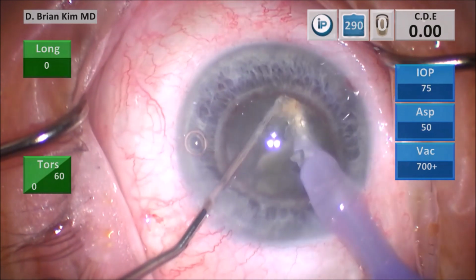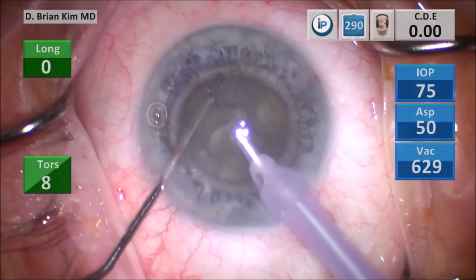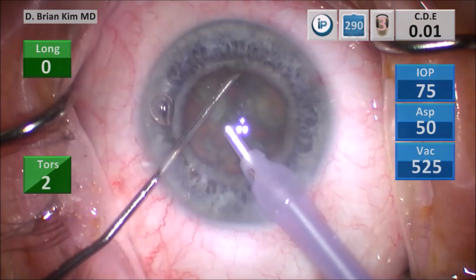I place the chopper out to the contralateral equator, again, making sure I'm underneath the epinuclear material. I rotate my hand 90 degrees so the chopper is facing down, and then I pull the chopper centrally towards my stationary phaco tip in the middle, and I'm able to crush the right heminucleus.